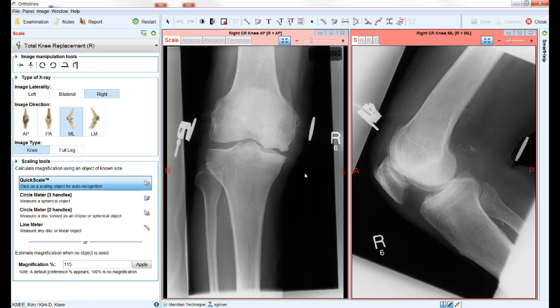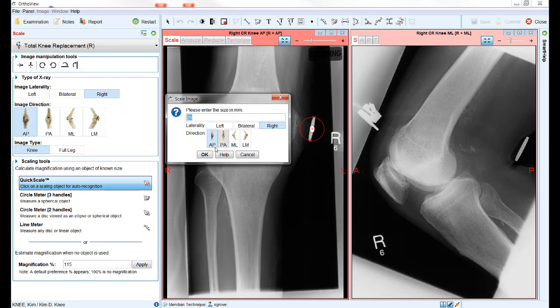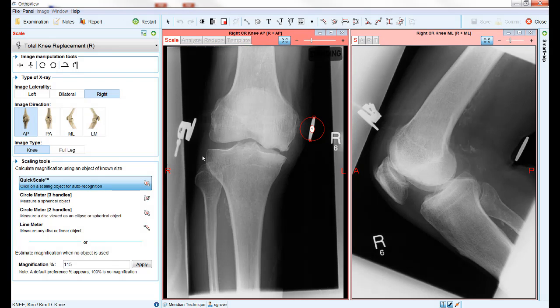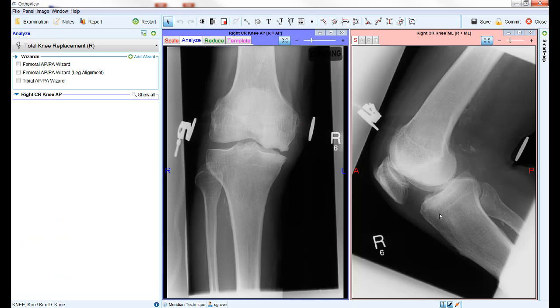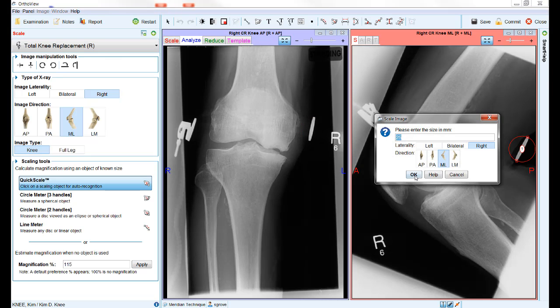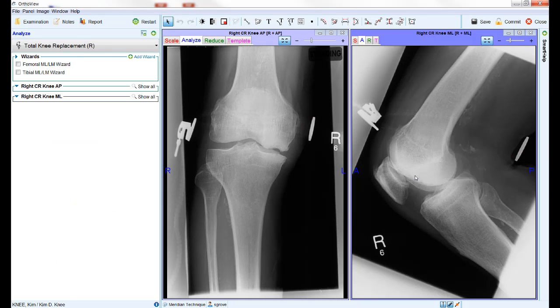Scaling in this case uses a marker to calibrate the image. As there are two images, each is calibrated independently. After calibrating the image, the software automatically moves to the appropriate step for the chosen procedure.